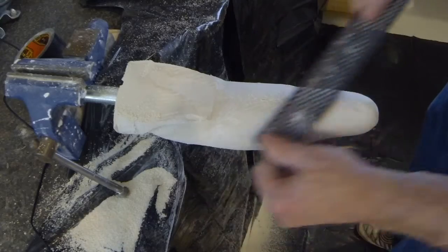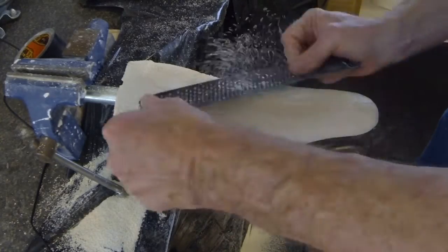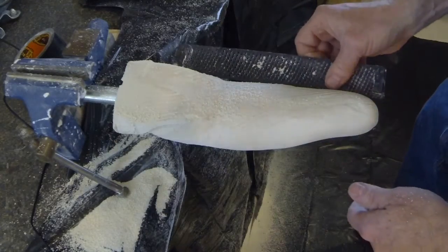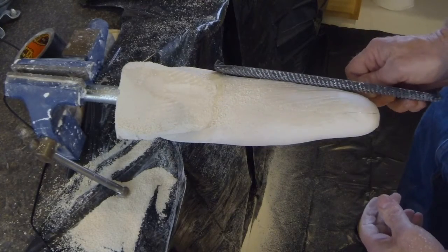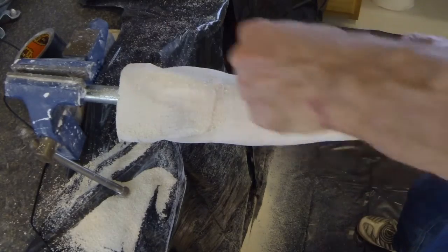Remove cast material with a ½ round file, removing any high spots. Slightly more plaster is removed just proximal to the end of the radius and just distal to the olecranon to create firm contact with the residual limb in these areas. These areas are loading areas for lifting and create a force couple.